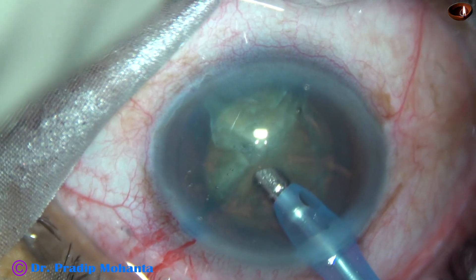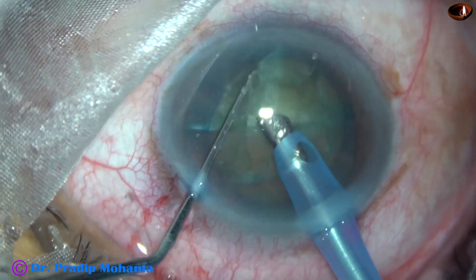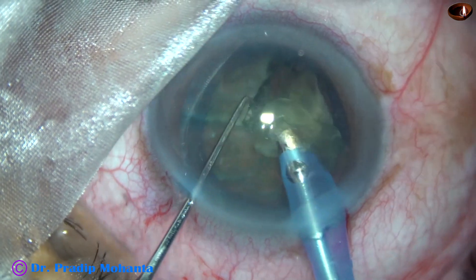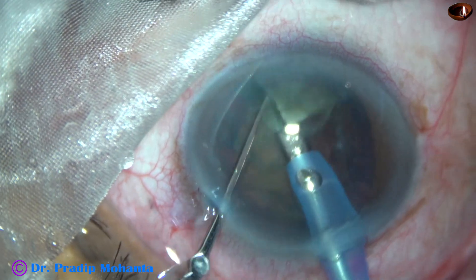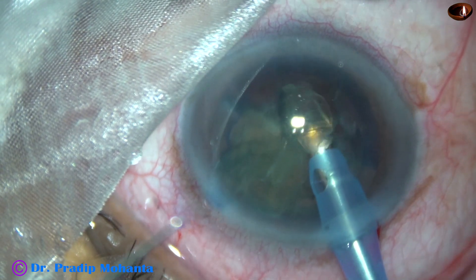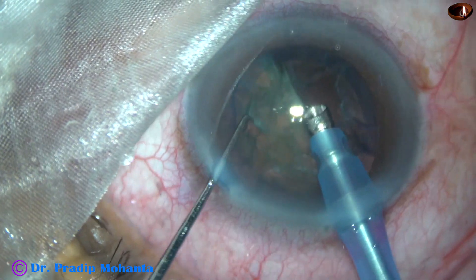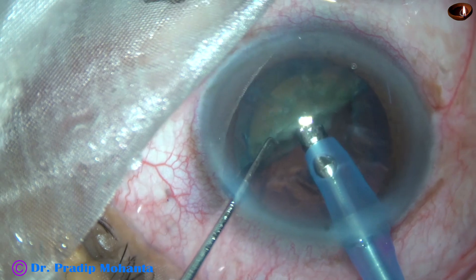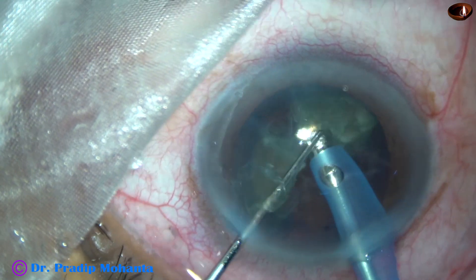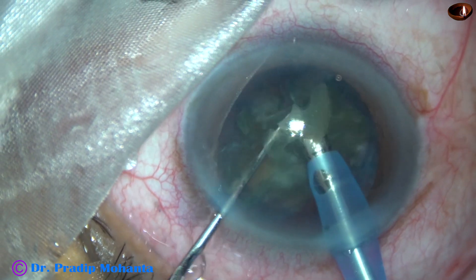See how easy it is to emulsify the pieces — just go in, use the chopper to lift up one piece, and start emulsifying. This is real time. One piece is emulsified; this is the other piece — this is also emulsified. Now I divide the other hemi-nucleus with the help of the phaco probe and the chopper, and start emulsifying one piece. And it is done.